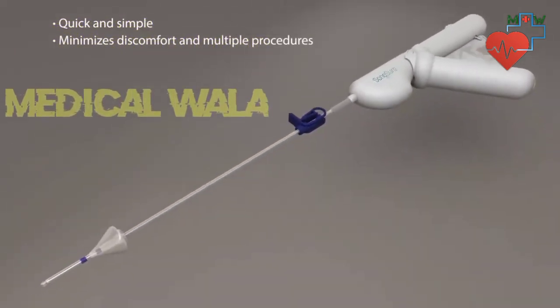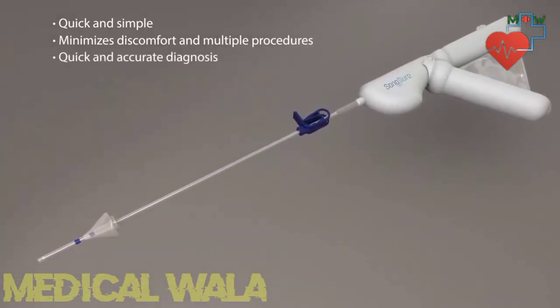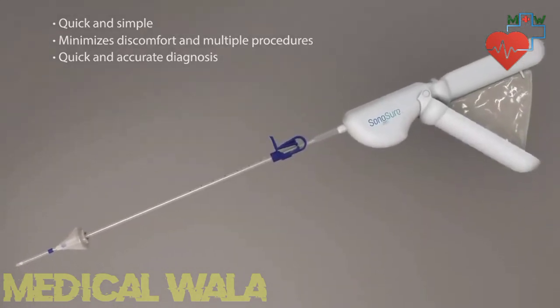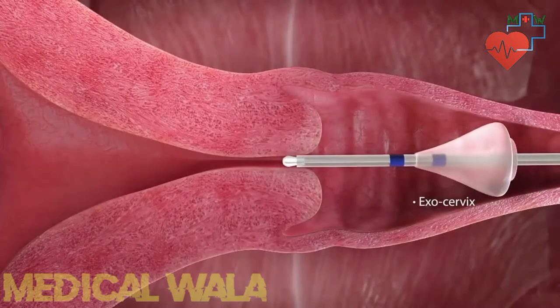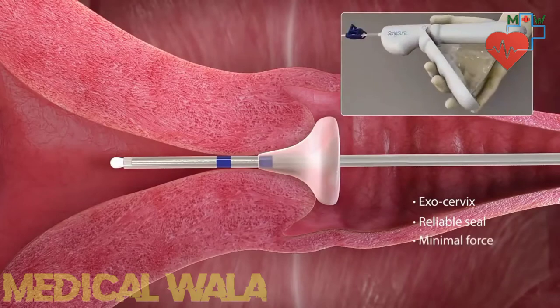In one procedure, the Sonosure allows the physician to quickly and accurately diagnose potential causes for abnormal uterine bleeding, and triage patients for appropriate therapeutic procedures. Sonosure's malleable acorn tip easily conforms to the shape of the exocervix, regardless of size or shape, and creates a reliable seal with minimal force.